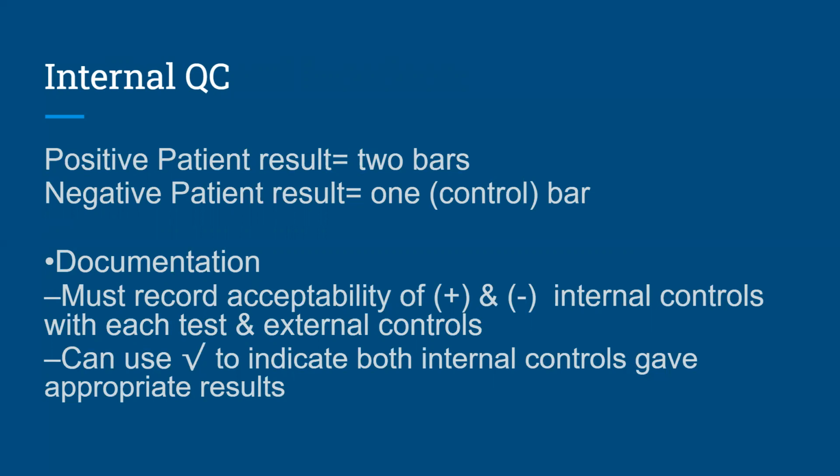These must be recorded each time a patient test is recorded. And you can use a checkbox on a log or within an electronic medical record to indicate that both the internal controls gave the appropriate results.